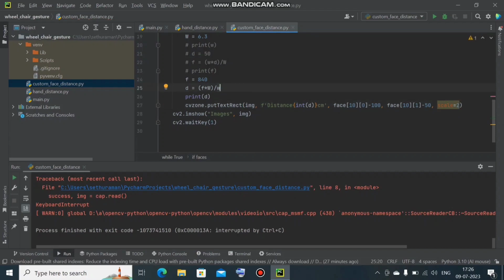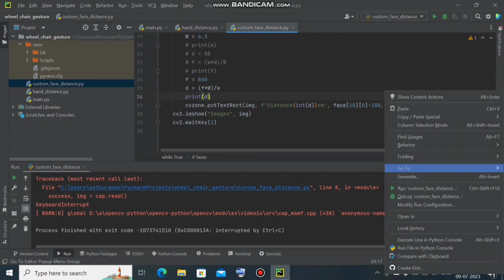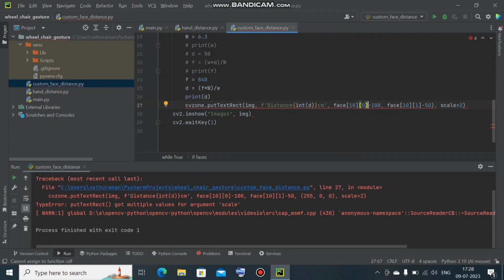I forgot to mention color, I guess. Which color does it need to be? Let us keep the color as 255, 0, 0 like that. Let us try running this now. Where it needs to display, we need to define it and mention it in the bracket. So now it will run.